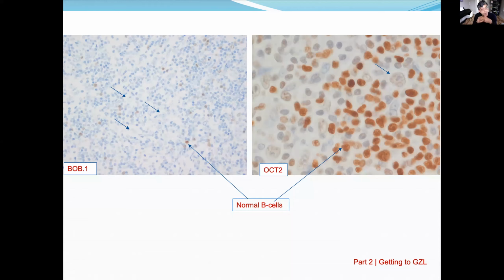And these cells are often confused in follicular lymphoma, where you have a lot of dendritic cells in the lymph node, and people get confused and grade them as centroblasts. And so you will overgrade your follicular lymphomas if you don't know to recognize your FDC, or follicular dendritic cell. They're usually doublets like that, and it's often called a kissing cell.